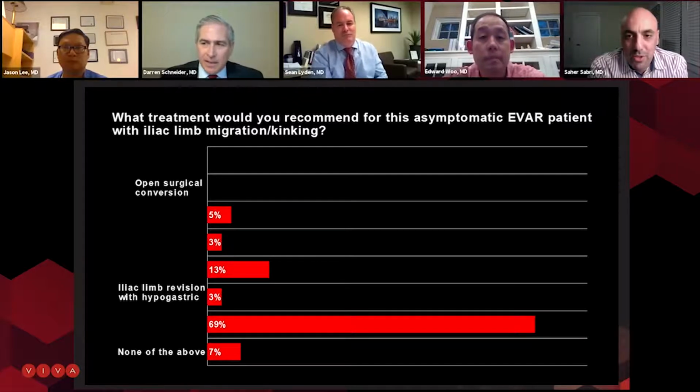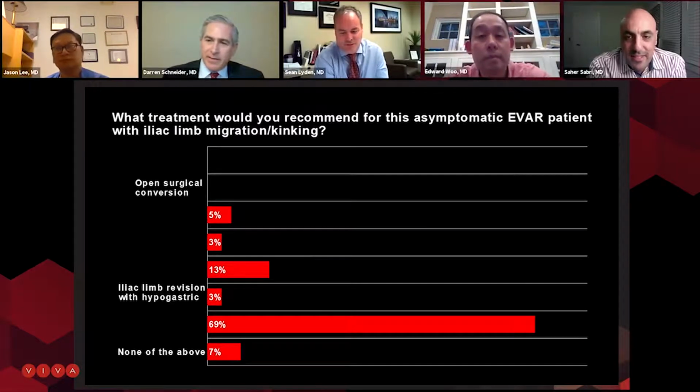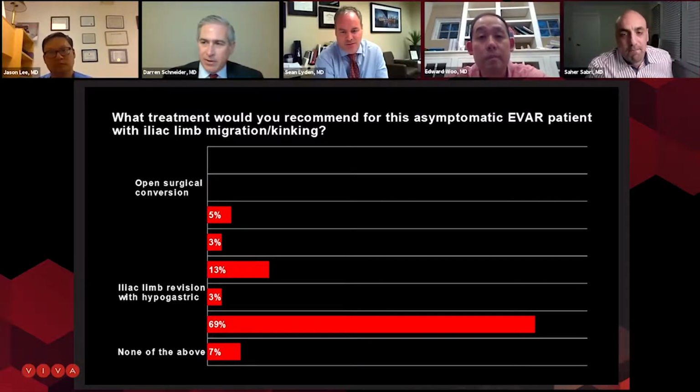I mean, is there a good use for them now? Yeah, well, I totally agree. I think that's basically sealing in an aneurysm. We now have devices where you can preserve the hypogastric artery and not seal in an aneurysm and get a more durable reconstruction. So I think that's important. I think there is a role for them, but I think it's limited.